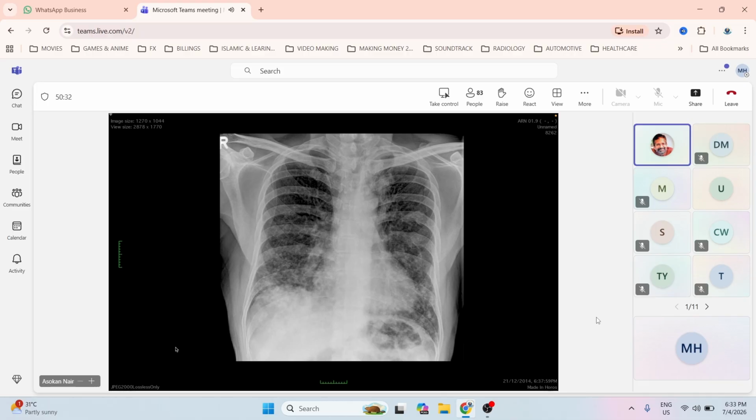And what are the common places that you get metastasis like this from? Okay, thyroid is one. What else? RCC, from renal. Yes. Melanoma, yes, not so common. Someone, a common one is where? Breast, yes, breast carcinoma or even lung carcinoma. So these are the common places, but thyroid and RCC would be the top two.